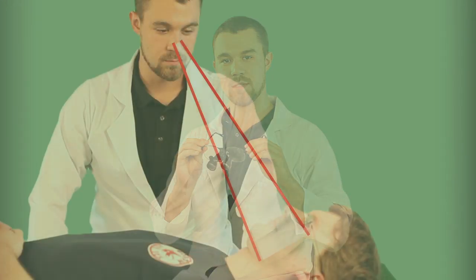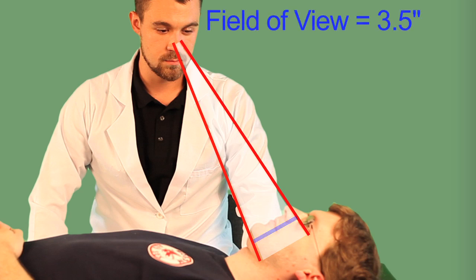For example, these large dental loupes have a working distance of 18 inches and a magnification of 3 times. With these two numbers, these dental loupes will have a 3.5 inch field of view and a depth of field of 5.5 inches.